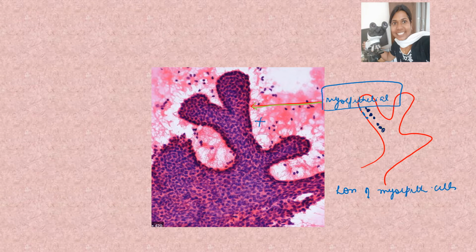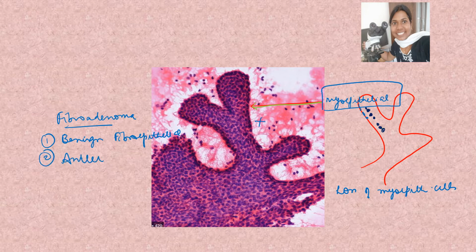So far what we have learned about fibroadenoma is that usually it's a mobile lump, so it can move around in different places in the breast, so it's also called breast mouse. Pertaining to pathology, it's a benign fibroepithelial lesion. And on FNAC, what you can see is the antler horn or staghorn appearance of cells with myoepithelial cells. Then you can have fibromyxoid stroma.